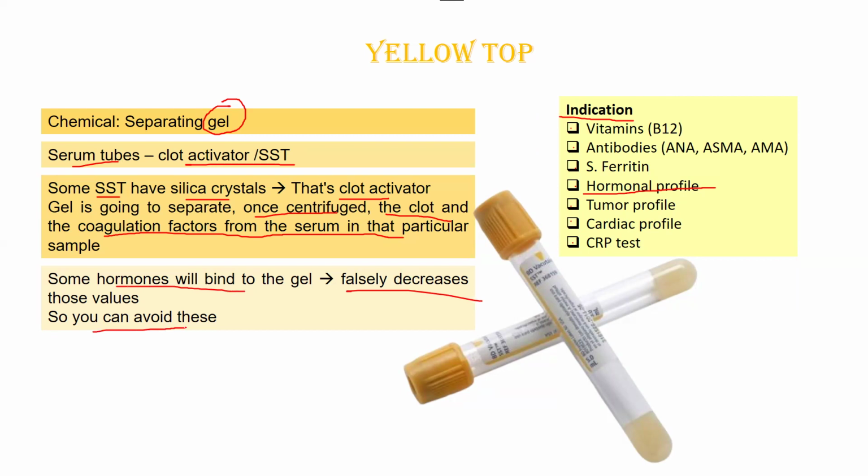So it's preferable to avoid the yellow top tube. Although hormonal profile is mentioned in its indications, it is also discouraged because some hormones will bind to that gel.